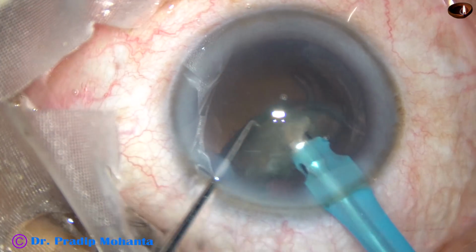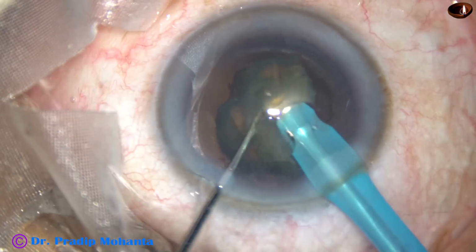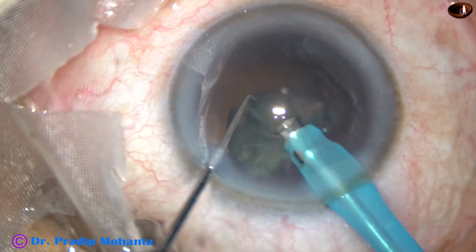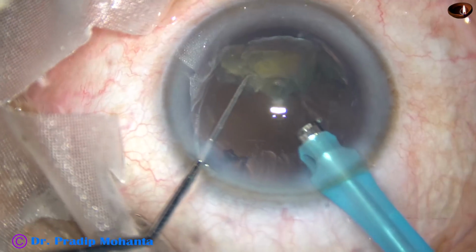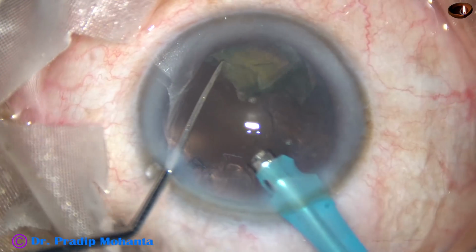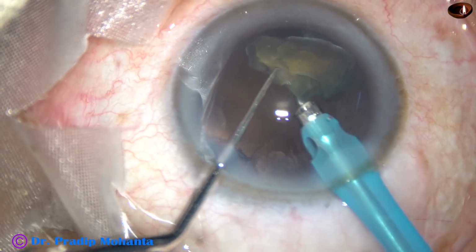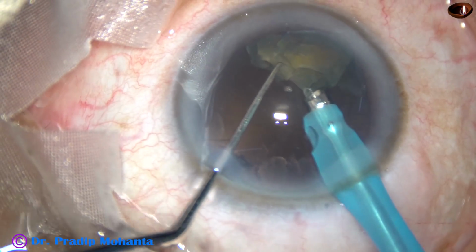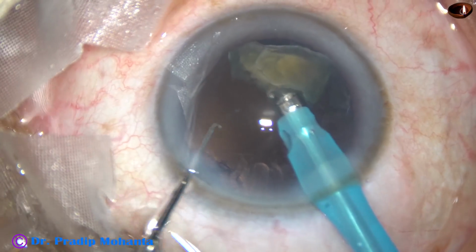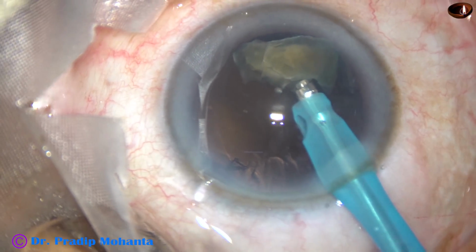At this moment, I noted that there is a small rent, just a flap of the posterior capsule, and I have to take care of it right now.